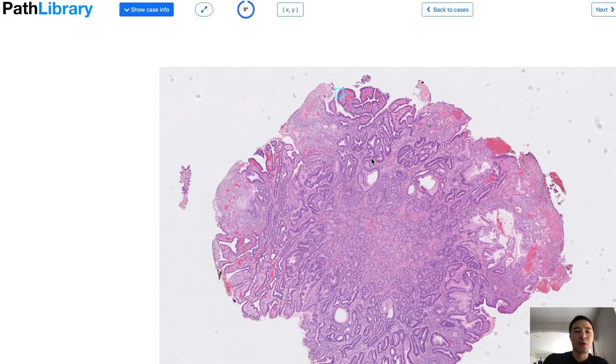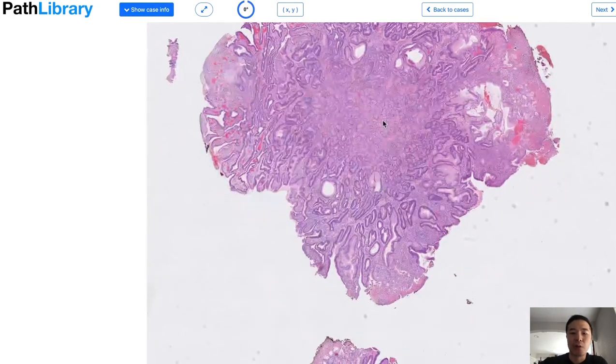And also, the area of the stomach where the hyperplastic polyp develops is very reactive, right? It's undergoing chronic irritation. So you just always want to put in the back of your head that I want to rule out dysplasia.